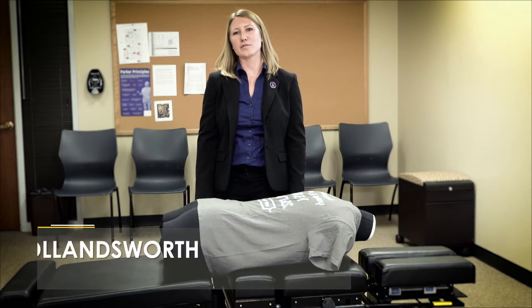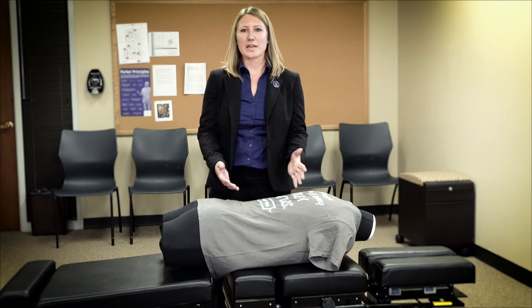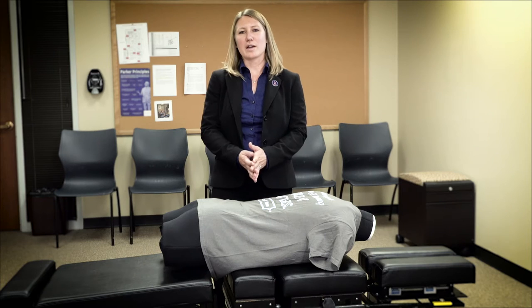Hello, my name is Dr. Dana Hollinsworth. Welcome to the Force Sensing Lab. I am a faculty member here at Parker, and I have the challenge and the opportunity of bringing all 750 of our students through this one table, using one mannequin, so they can learn feedback on their adjustments.